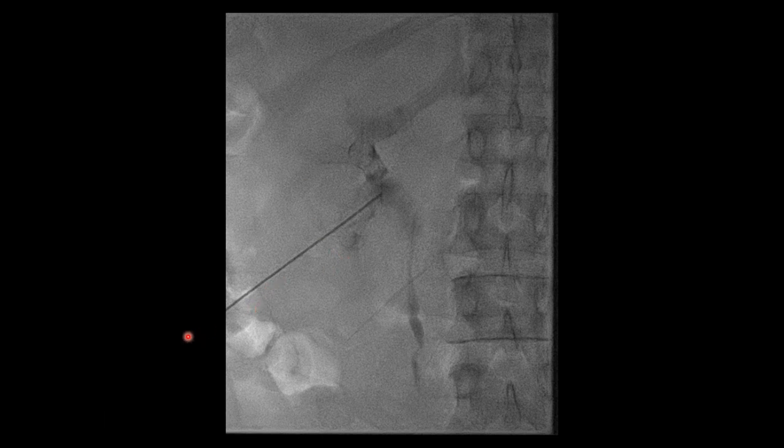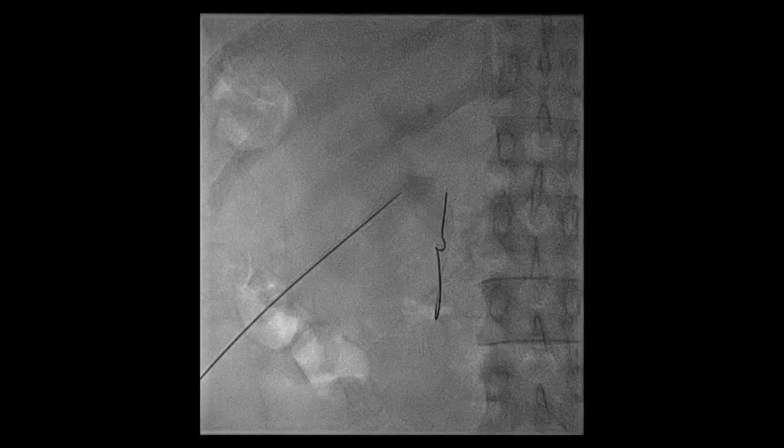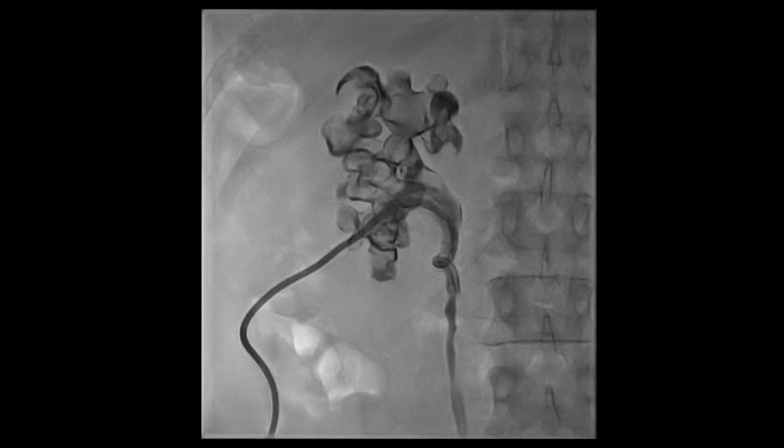And that's exactly what we did with ultrasound guidance. We guided our needle right onto that stone and confirmed it with fluoroscopy. We injected some dye, which showed we're in the collecting system. So then we want to get a wire down, which can be a little tricky when there's lots of stones in there. But with some perseverance, we got our wire into the ureter, and then we eventually got a catheter over it. And I think this is one of my favorite images that I've taken in IR, just because the stone burden is crazy, and I just think it looks cool. So you see contrast outlining the collecting systems, and also coating all the stone that's sitting in there, which is pretty neat.